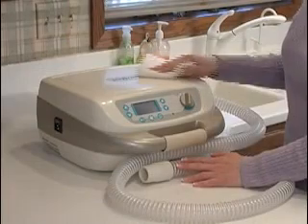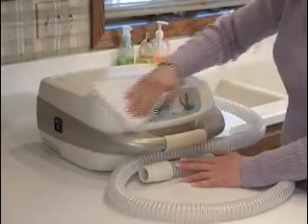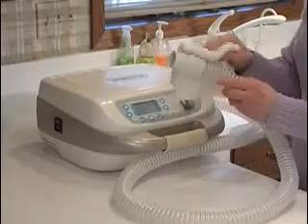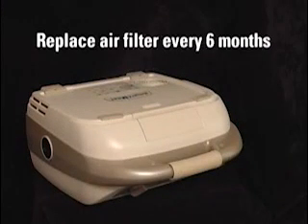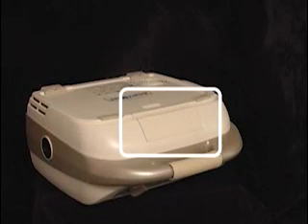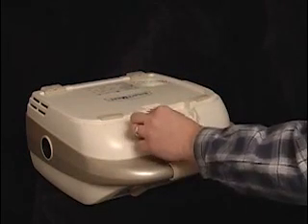Your SmartVest Airway Clearance System is simple to maintain. Clean the air pulse generator and air hose with a cloth dampened with a non-abrasive household cleaner. Be careful not to let any liquid run inside the generator. Allow the hardware to dry completely before resuming use. Routine preventative maintenance requires replacement of the unit's air filter every six months or after 200 hours of use. Begin by removing the filter access door on the bottom of the generator — press the Release tab and pull up on the access door. Carefully remove the felt filter, install a new filter, and close the access door.